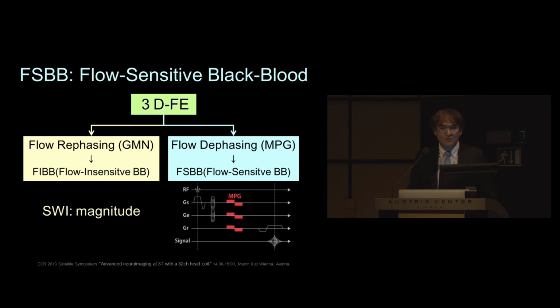So usually, for the stroke imaging, you use 1,000. But in this case, just 1, or less than 1 is OK. And after that, refocused again, applied and refocused again, and image data are acquired. So this can be used for the visualization of the small arteries, actually.